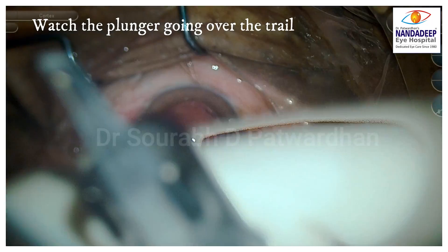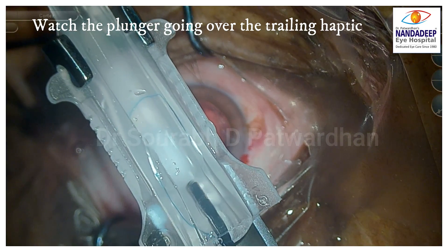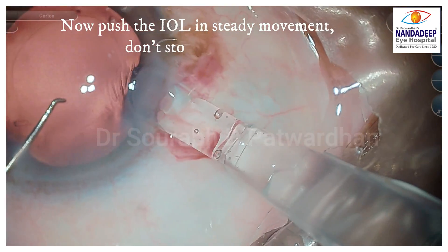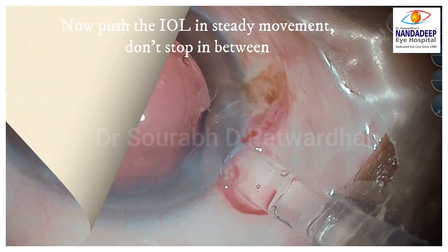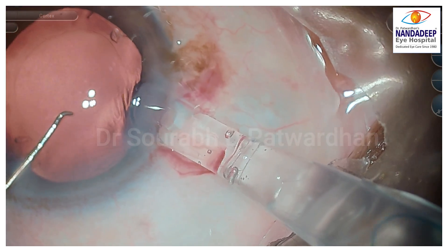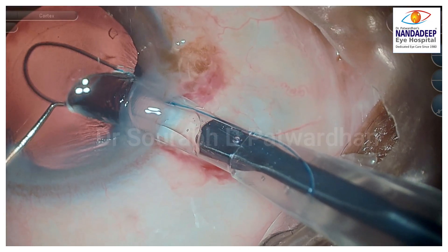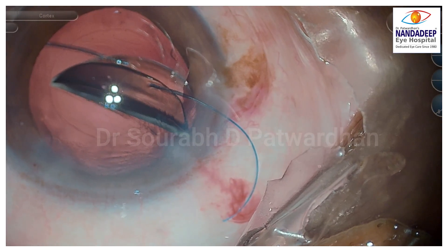Now place it over the injector — this is the Monarch 2 injector. Watch the plunger very carefully going over the trailing haptic so it doesn't damage it. Push the optic until the point where the cartridge is not yet narrow; if the IOL is pushed right to the end of the cartridge, that's when it can get kinked. So always push it only to that point and leave it. When injecting, push the IOL in a steady movement and do not stop in between — stopping gives time for the leading haptic to get kinked. The injector must press against the incision so it doesn't come out. Inject in a steady fashion without stopping, so the leading haptic doesn't get kinked. You can use the 3-piece IOL through a 2.8mm incision — you don't necessarily need to enlarge it to 3.2mm for using the B cartridge.